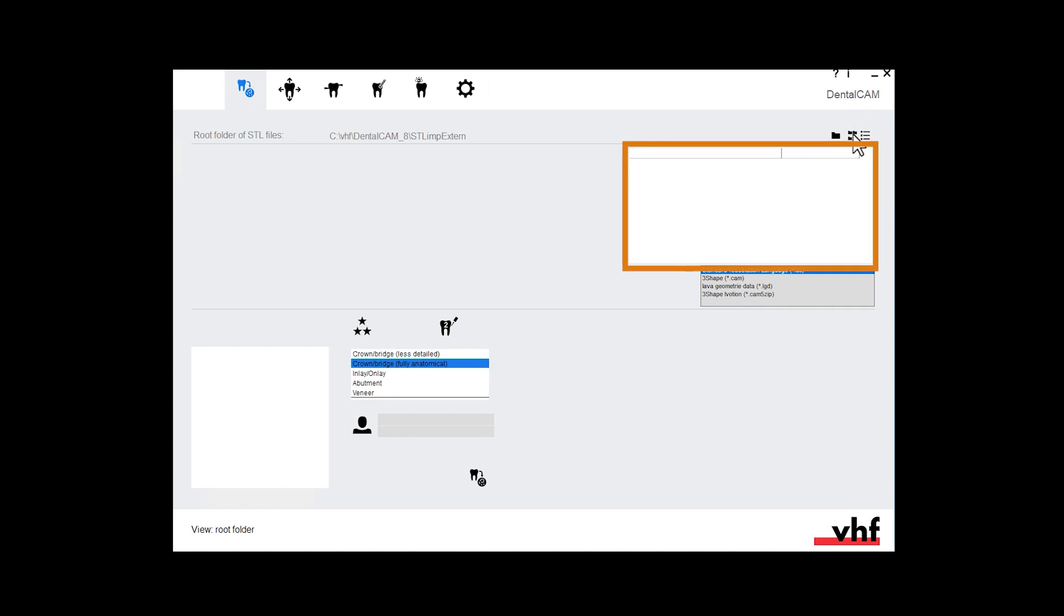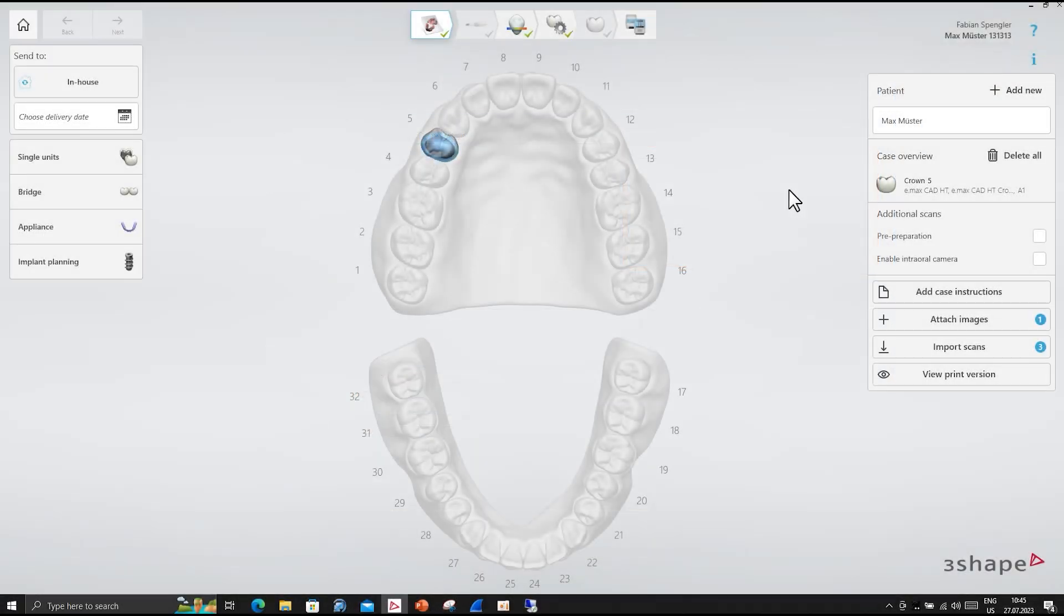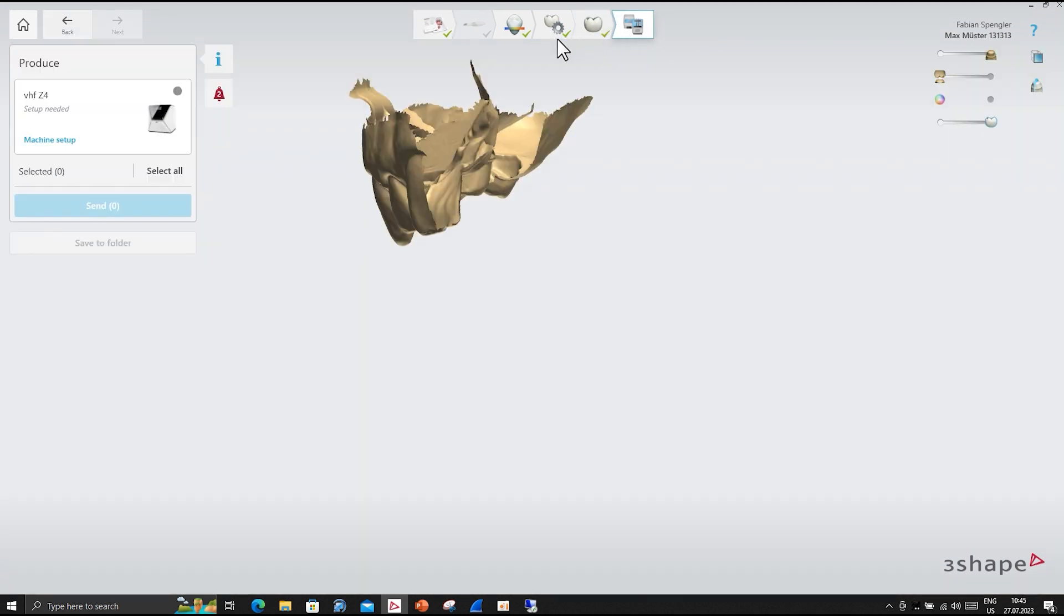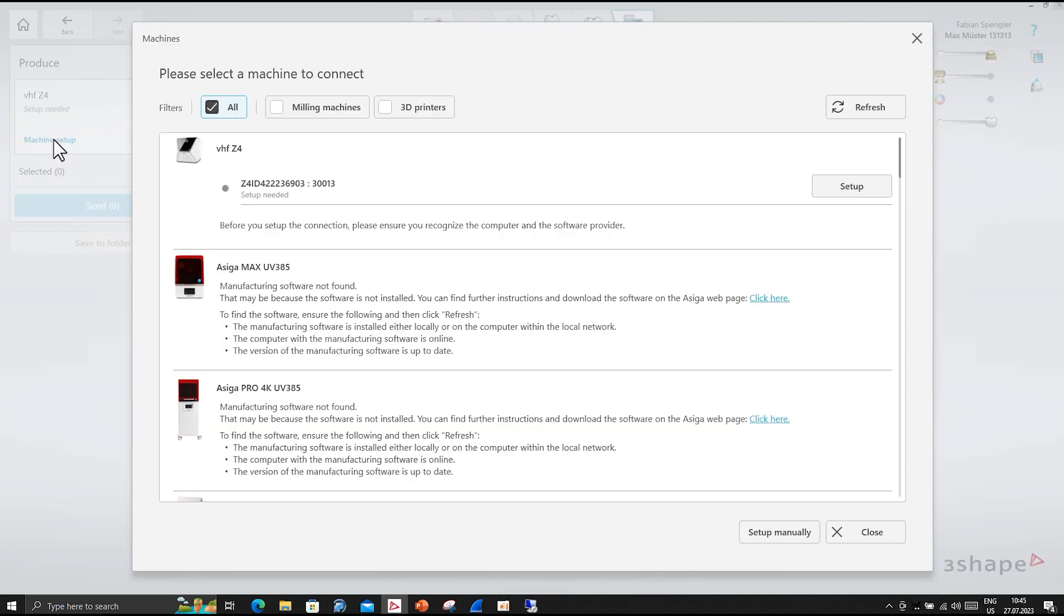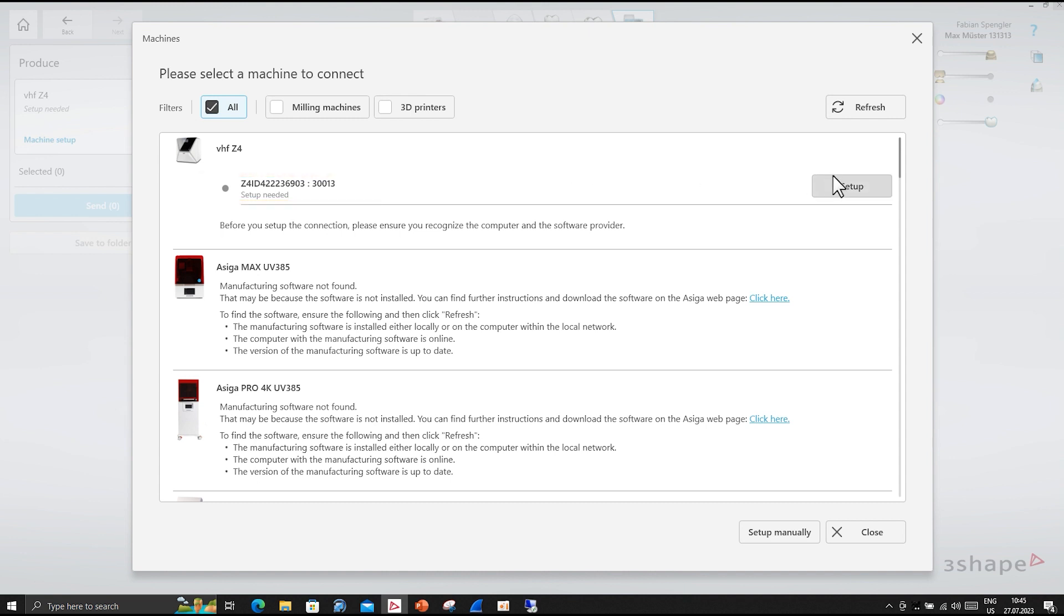DENTALCAM displays the root folder in the STL import view. Open TRIO's design studio on your CAD computer. In the produce section, select machine setup. Scroll to the entry for your machine. You can identify the machine by its serial number. Select setup. The indicator turns green once your machine is connected.